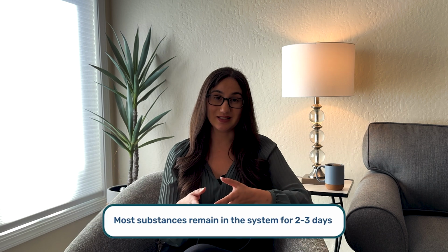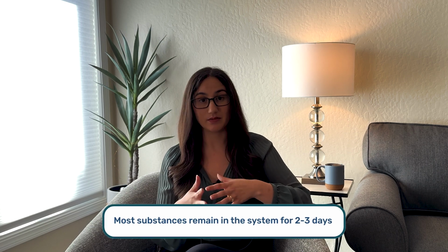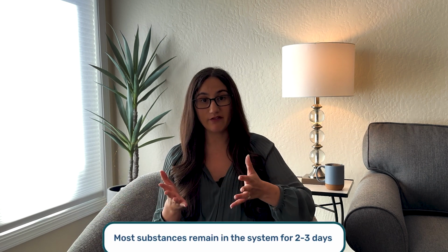Typically, a lot of substances really only remain in the system for about 2 to 3 days, sometimes a little bit longer, but on average, there's a pretty short window of time where it can be detected. That's also why, especially in early recovery, we recommend testing approximately 2 times a week, because there is such a short window for certain substances.